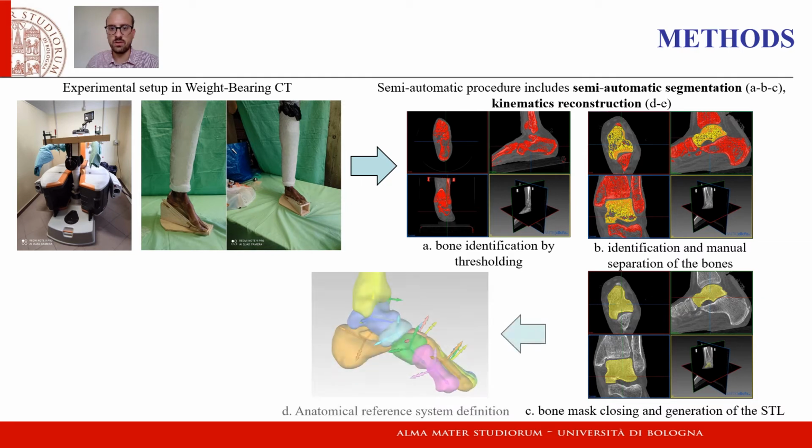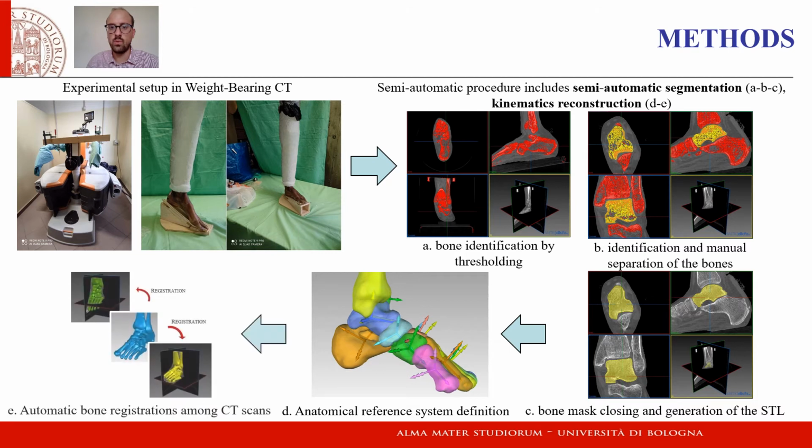After the segmentation, we defined anatomical reference systems for each bone. We performed bone registration by an automatic algorithm based on iterative closest point defined in a MATLAB routine from the neutral to the specific scan to define bone kinematics.